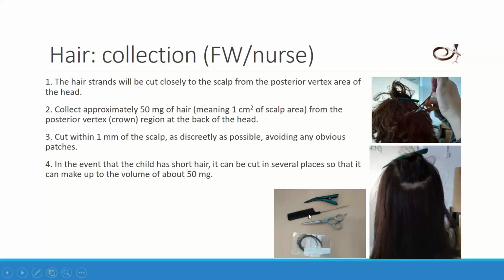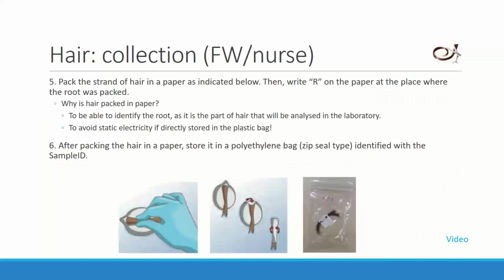And we recommend you use this hair comb here. You can see it in the image, because with this one, it's easy to move the hair, take it, and cut. This is according to the experience of Sylvia and Nuria. And once you have the hair sample, you have to put it in paper, okay? So make a pack like this, here.